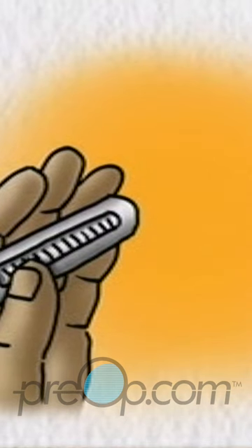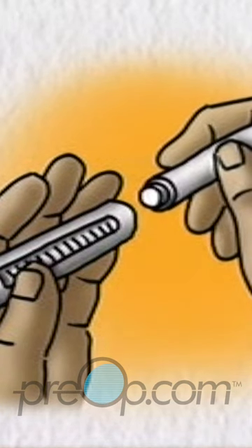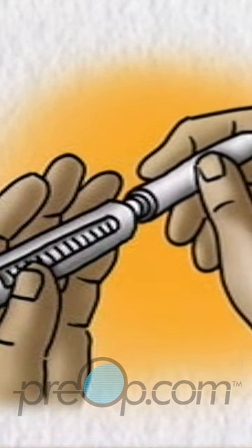Pick up the cartridge holder, shake out the used cartridge, check that the new cartridge contains the correct insulin and insert it metal end first into the holder.